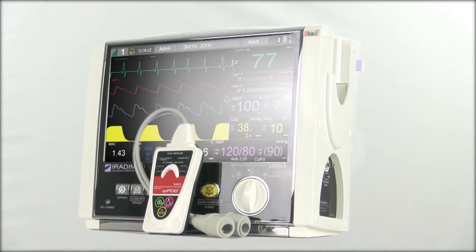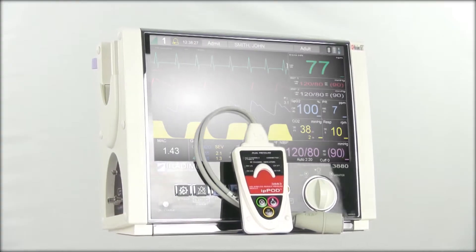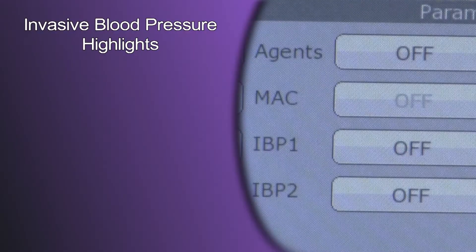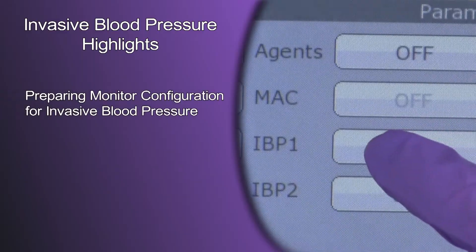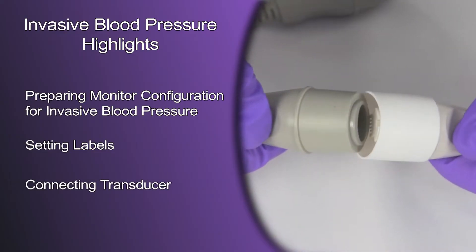In this video, we are going to review the steps for preparation and application of the invasive blood pressure wireless pod for the 3880 MRI patient monitor system. We will focus on preparing the monitor configuration for invasive blood pressure, setting labels, and connecting transducers.